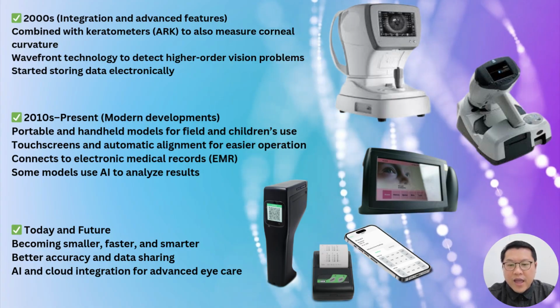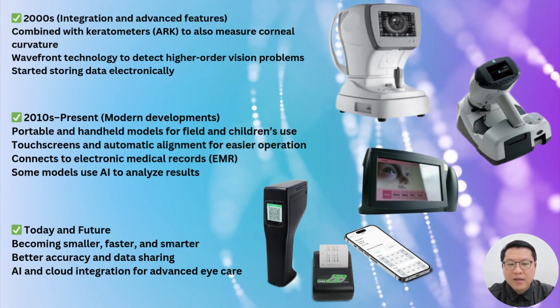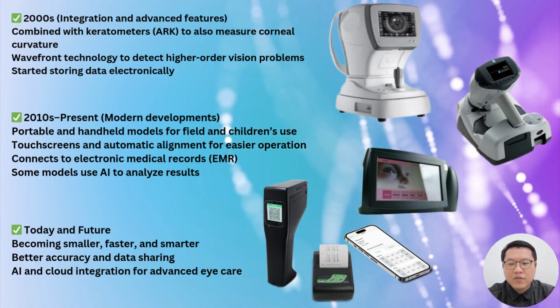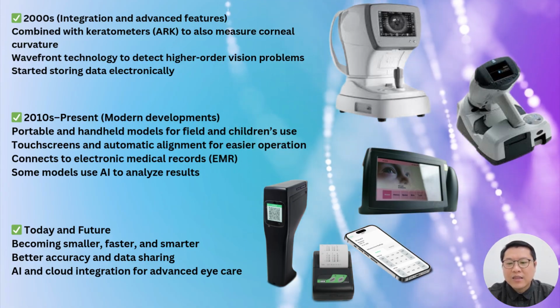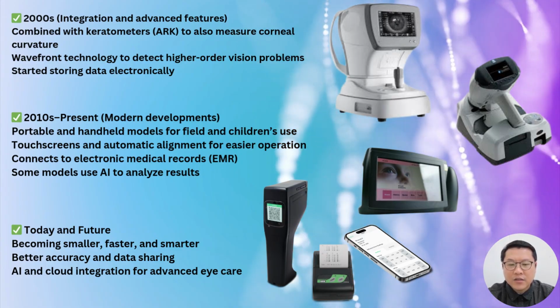The autorefractor has developed from a bulky, basic machine into a compact, intelligent digital device. This reflects the broader shift in healthcare towards automation, portability, and smart diagnostics, making eye care more accessible and efficient for everyone. Thank you.